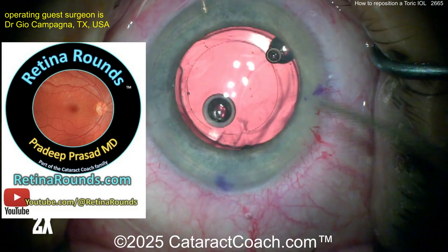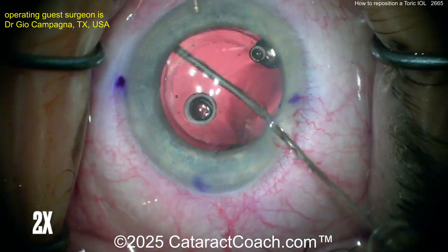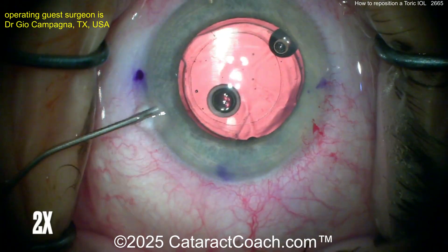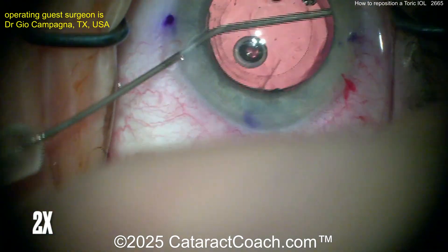Check out RetinalRounds.com — you are shortchanging yourself by not learning from Retina Rounds. Now, more viscoelastic to really get the capsule bag open. It looks like this patient had surgery quite a while ago — I'd say at least many months. Once that's opened up, you should be able to free up the haptics.